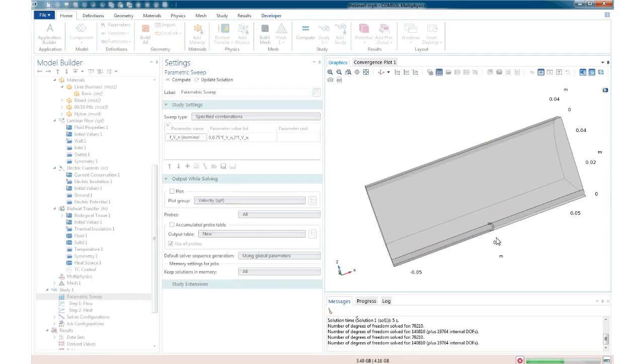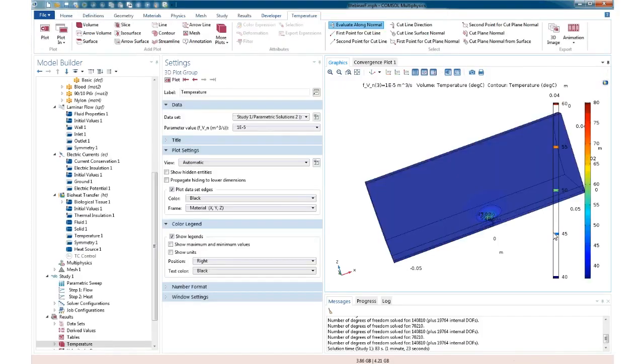Now, the multiphysics that's going on is I've got conductivity, which varies with temperature, interacting with current, which is creating heat, which is diffusing out through here, and which is being carried away by blood flow, which is moving at a velocity which is determined by doing laminar flow. So every one of those processes is very simple on its own, but the processes, the way they combine, is less simple. So let's see what's happening here.